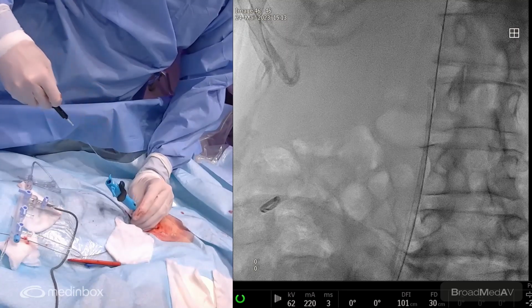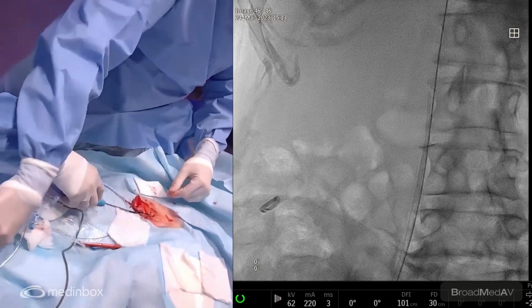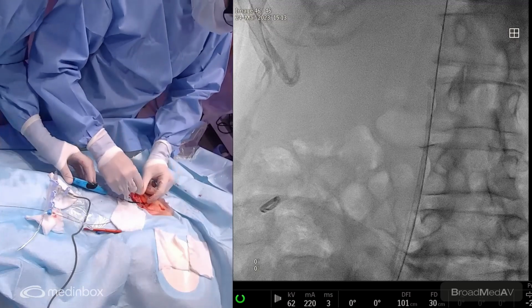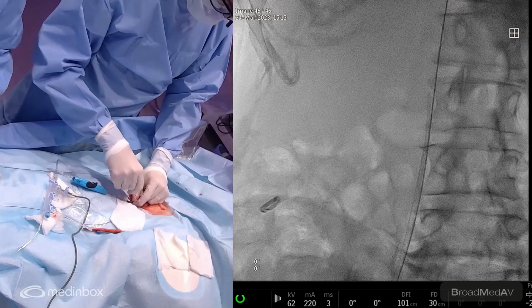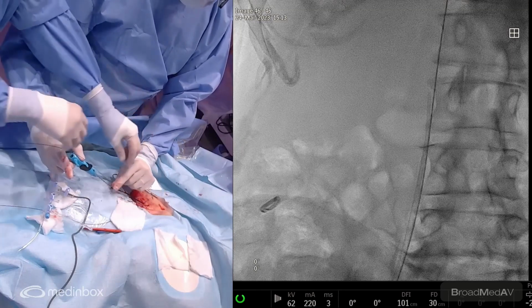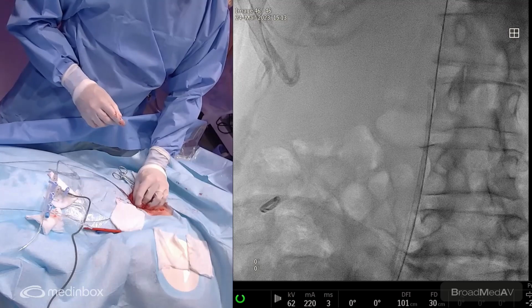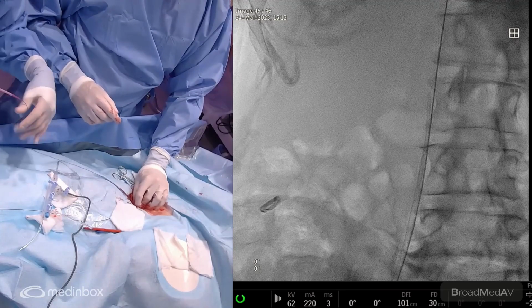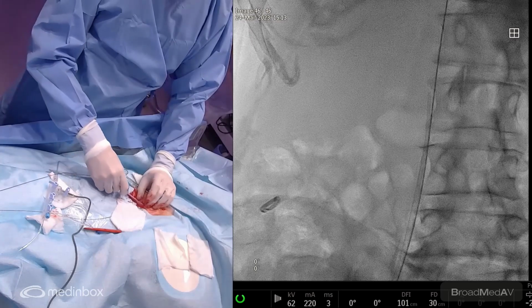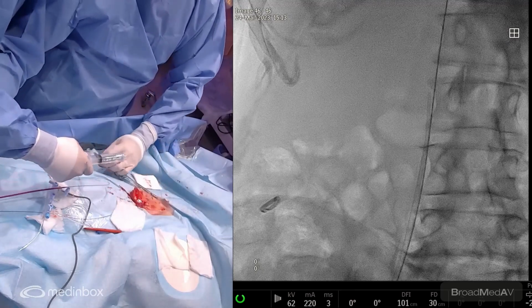We just took a look on fluoro to be sure that we are well aligned with the IVC. Perfect. First preclose in place. With this access, we will put the 10 French introducer for the ICE. Got wire. Good. So, 10 French introducer. I like a longer introducer to be sure that we are well in the IVC. When it's too short, sometimes you can buckle when you try to go out from the introducer with your ICE probe. Okay, nicely in. So this is introducer number one, 10 French for the ICE, that we will flush.